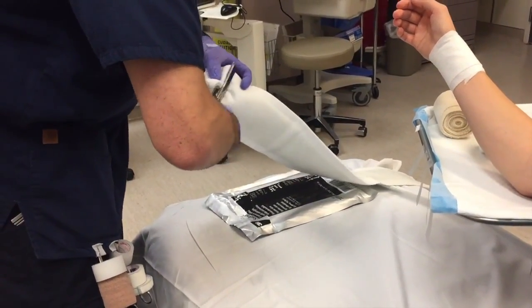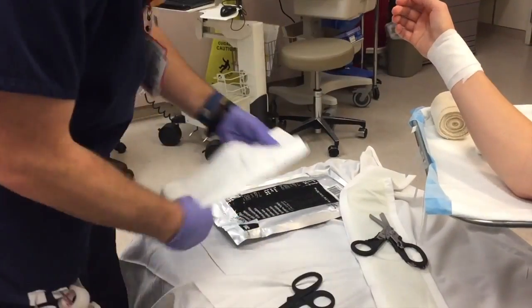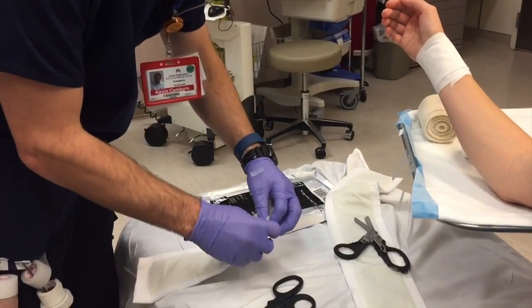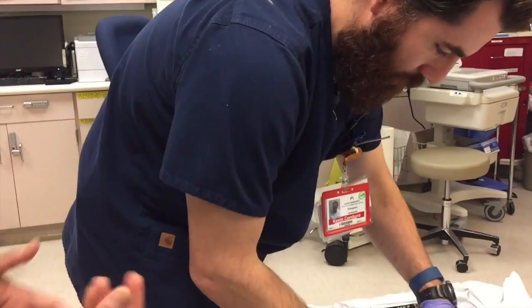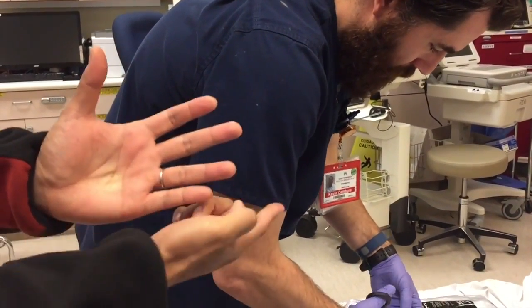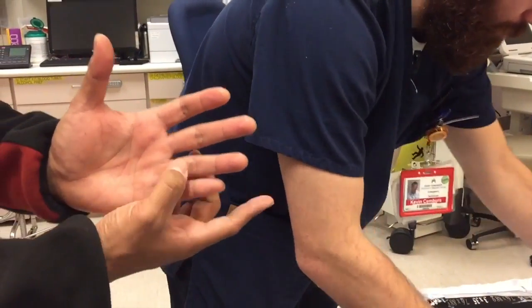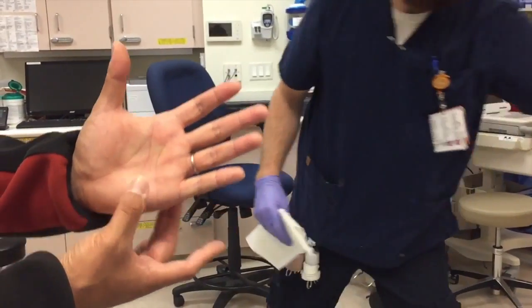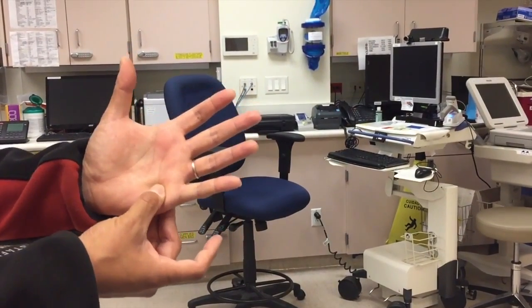The splint that we're putting on today is an ulnar gutter, and it's usually used for fractures of the 4th or 5th metacarpal, also known as your boxer's fracture. That's your 4th and 5th. It also depends on how thick you want it, because if it was the 4th metacarpal, then you'd probably want something bigger than a 3-inch. This is a 3-inch, so you might want something a little longer, maybe a 4 or 5-inch. But usually boxer's fracture, 4th or 5th metacarpal.